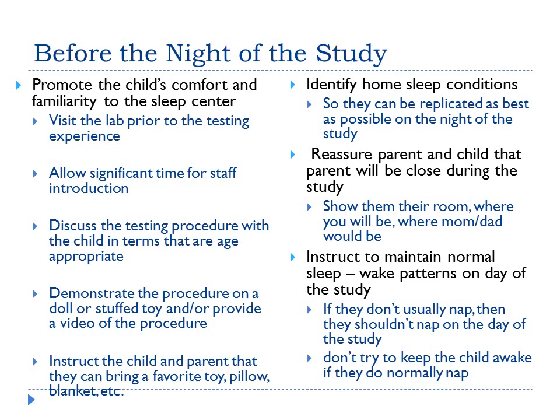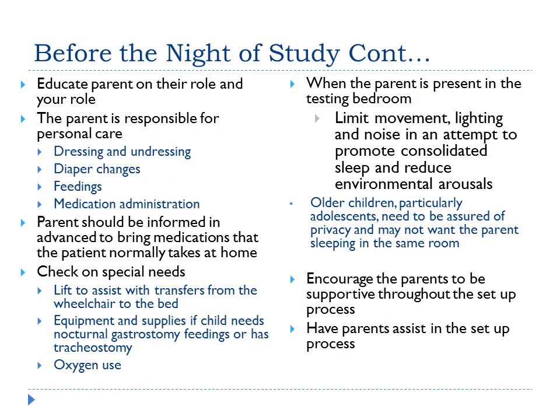You want to instruct the parent and child to maintain a normal sleep-wake pattern on the day of the study. If they don't usually nap, then they shouldn't nap on the day of the study. On the other hand, if they normally take a nap at 2 in the afternoon, then you want to make sure they repeat that on the day of the study. Don't try to keep the child awake if they normally do nap. Try to repeat the exact same procedures that the people do at home on the day of this study as much as possible. Let's go on to our next slide.